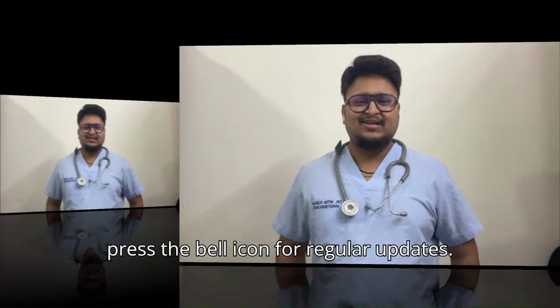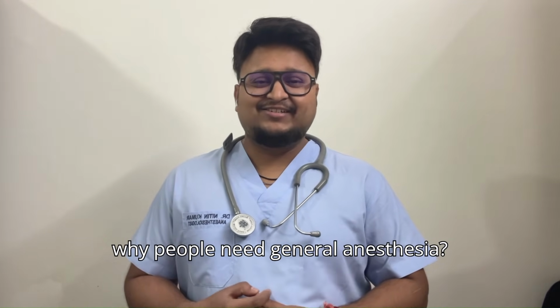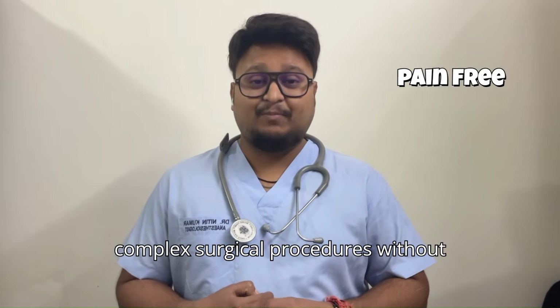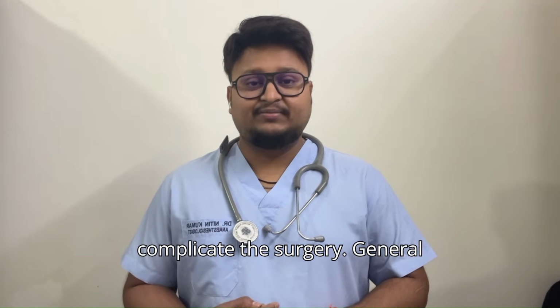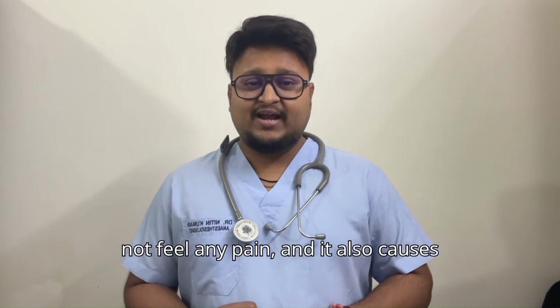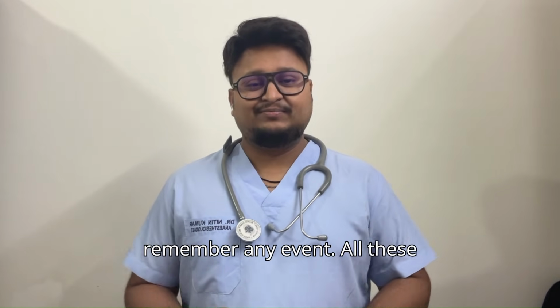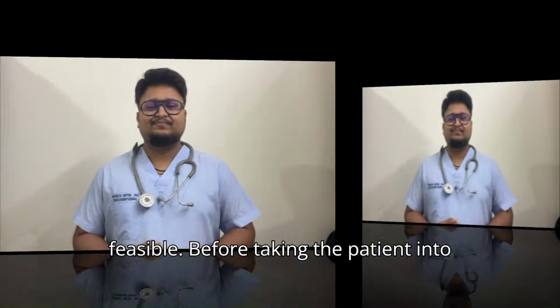Let's begin this video. So do you know why people need general anesthesia? People need general anesthesia to undergo complex surgical procedures without experiencing pain, distress or involuntary movements that could complicate the surgery. General anesthesia induces a state of unconsciousness in which the patient does not feel any pain, and it also causes amnesia in which the patient does not remember any event. All these things make the surgery easy and feasible.